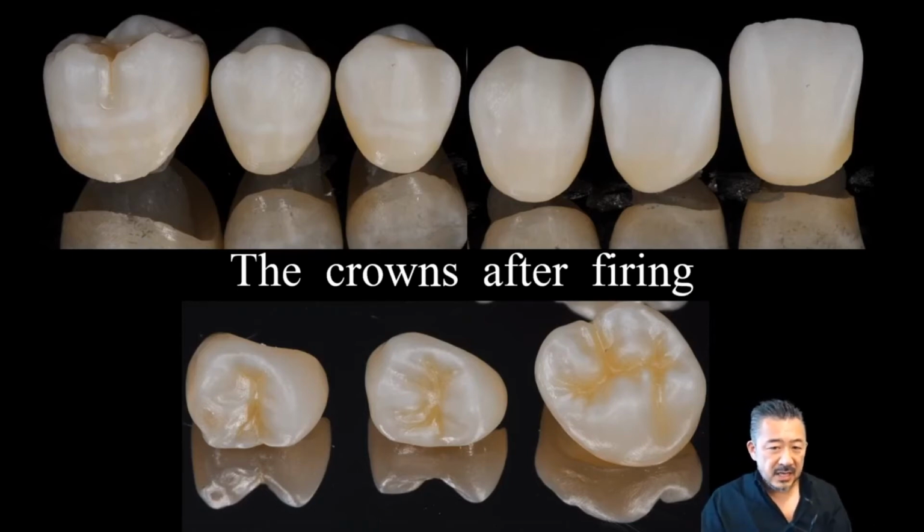This is because if the color tone is too deep, or the part you want to express is overemphasized at this point, it's difficult to adjust. That's why at this point you should aim for about 50 to 70% of the final color you want to reproduce. This is just my suggestion.